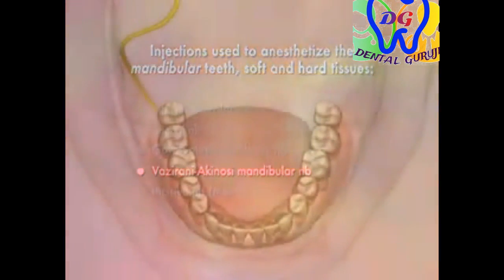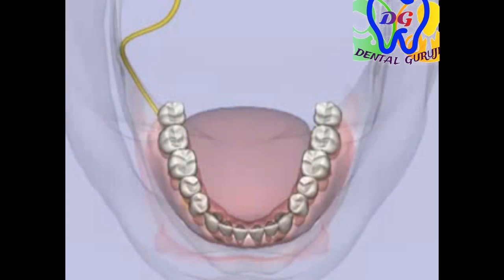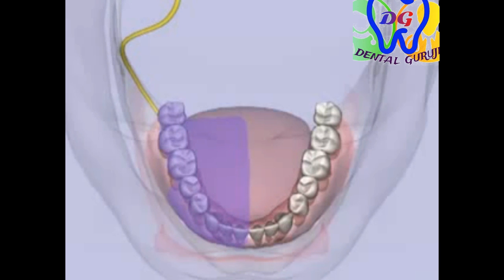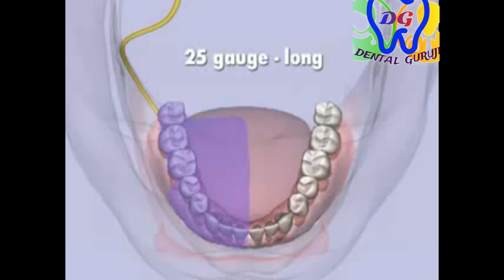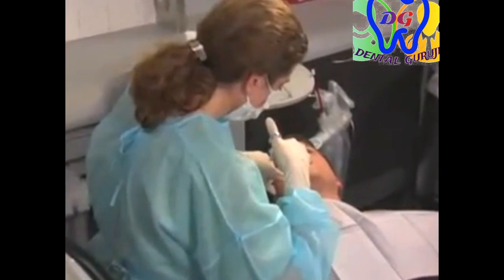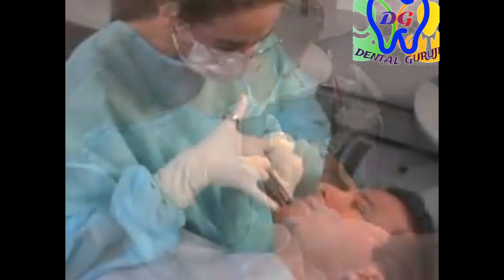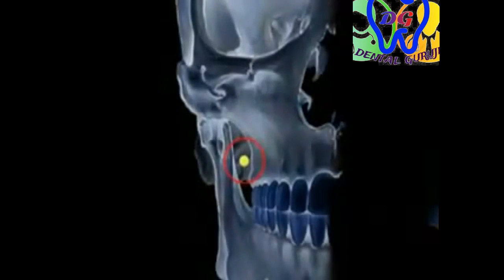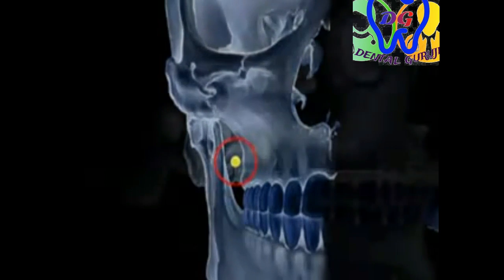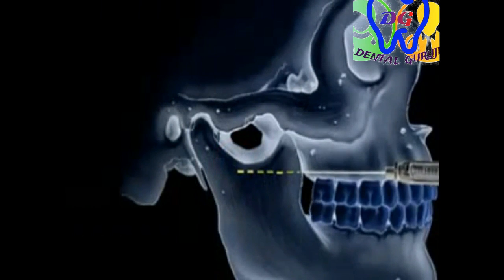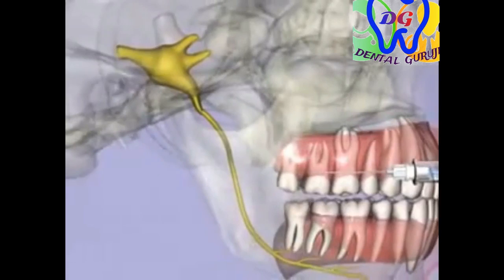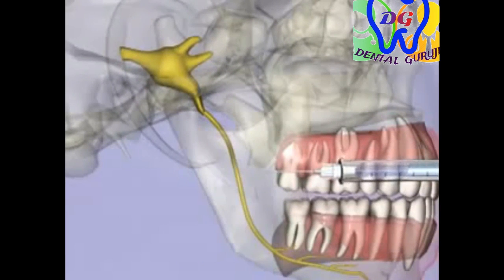The Vazirani-Akinosi closed-mouth mandibular nerve block provides anesthesia to the 8 mandibular teeth, the buccal soft tissue and bone anterior to the mental foramen, the anterior two-thirds of the tongue and the floor of the oral cavity, and the lingual soft tissues and periosteum. A 25-gauge long needle is recommended. For the right or left Vazirani-Akinosi nerve block, the right-handed operator should sit at the 8 o'clock position facing the patient. The needle is inserted into the soft tissue on the lingual aspect of the mandibular ramus adjacent to the mucogingival junction of the last maxillary molar. With the bevel facing away from bone, the syringe is inserted 25 millimeters.